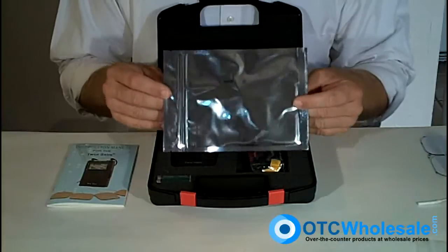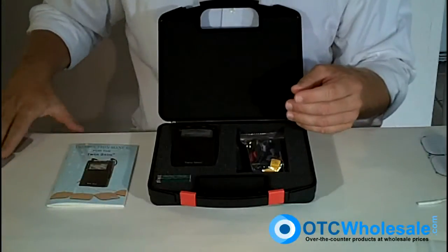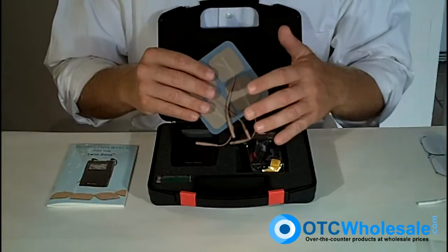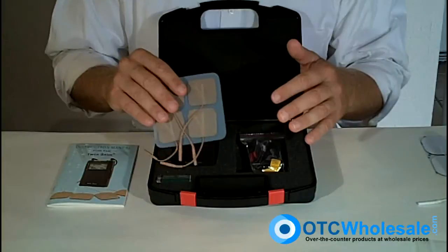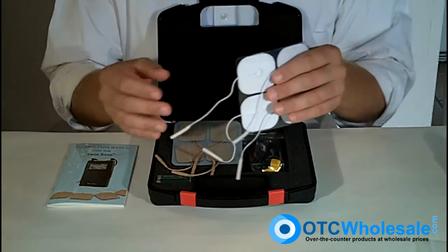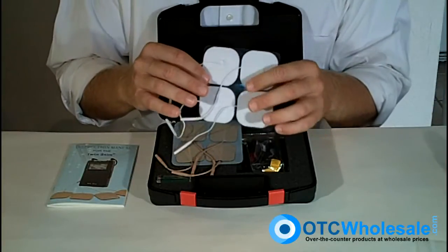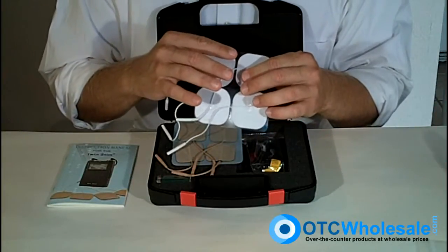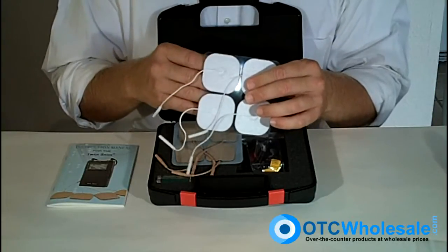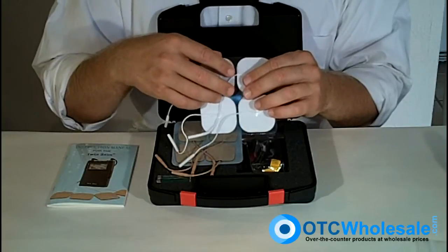This particular unit comes with four electrodes. These are economy carbon electrodes that come from the manufacturer. I can't stress enough that you probably ought to just make the small investment — just a few bucks — and get yourself some decent silver electrodes. With this type of electrode, you've got a silver substrate going on the back of the carbon pad, and that distributes the charge all the way across the pad.